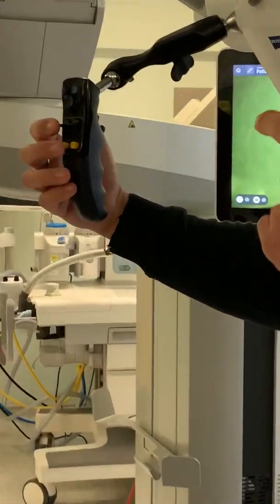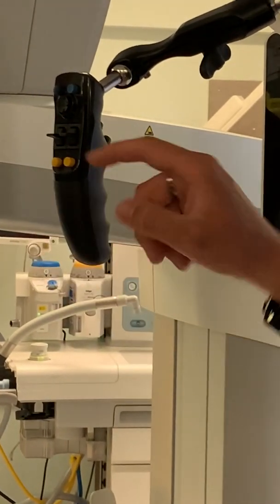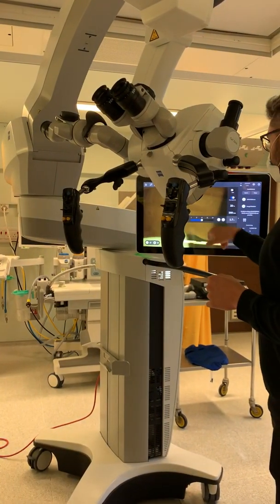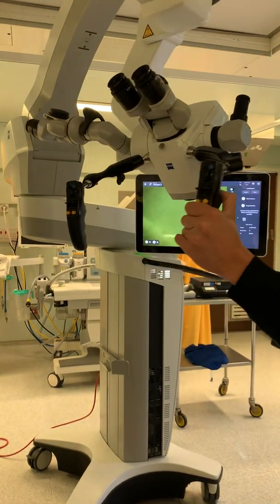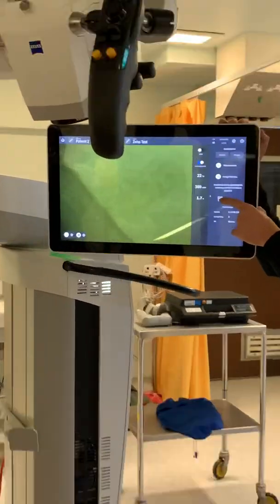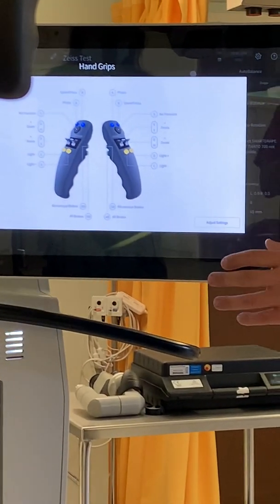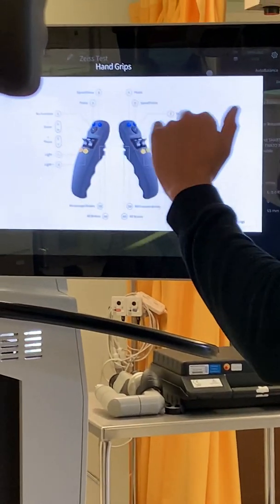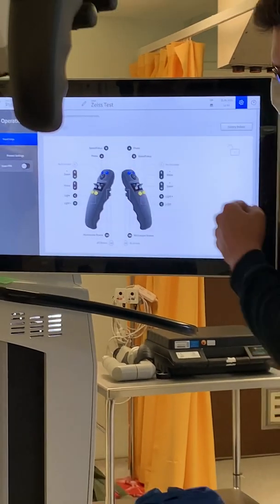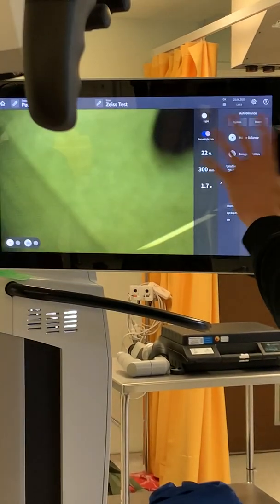Here you've got your focus and zoom, like on the other microscope, and down the bottom — identical on either side — is your light plus and minus. If the rate of change is too fast, just ask for it to be adjusted. If you get confused about what buttons do what, press the hand grips diagram and it will give you a quick overview of your configuration. To change anything — for example speed focus and photo on both sides — go to Adjust Setting, click on whichever one you want, and choose from the available options. As standard, this is what we'll leave it at.